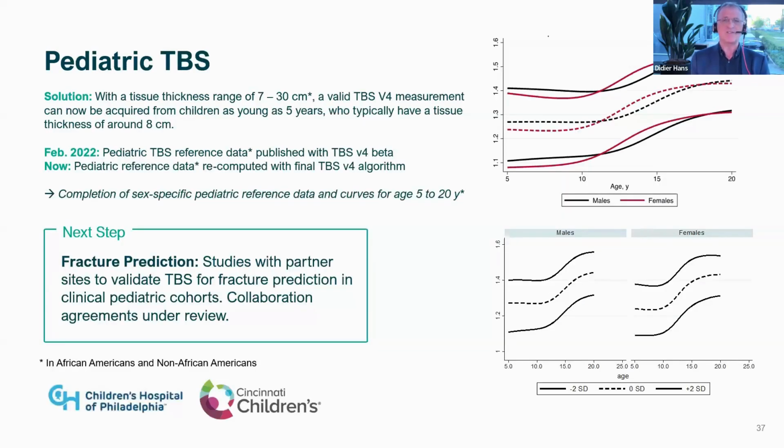Next slide. One of the benefits of moving toward tissue thickness is not only to take into account the morphotype, but also that we can extend the solution to a different type of population, such as pediatrics, because the current software, TBS 3.x and below, cannot be used for children, as BMI would be a wrong indicator for correcting soft tissue in those patients. So the idea of the new version is to take that into account.